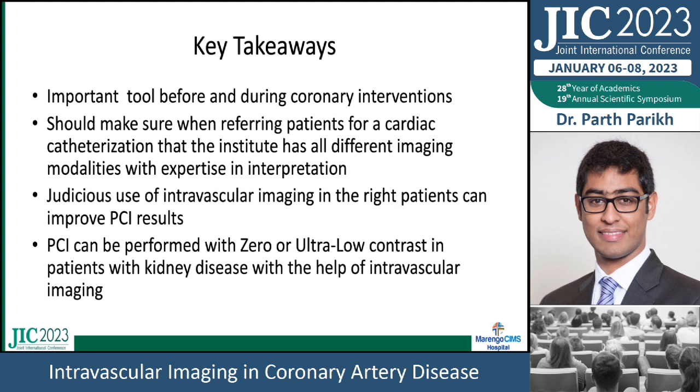One should always make sure when referring patients for a cardiac catheterization that the institute has all different imaging modalities with expertise in interpretation of imaging as well. Judicious use of intravascular imaging in the right patients can definitely improve PCI results. And I think most important for me has been that PCIs can be performed with zero or ultra low contrast in patients with kidney disease with the help of intravascular imaging.